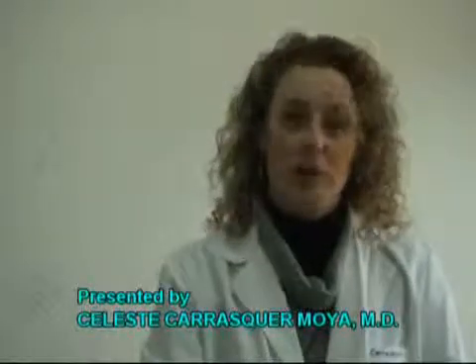Today's practice is to talk about orotracheal intubation. First and foremost, I would like to introduce myself.